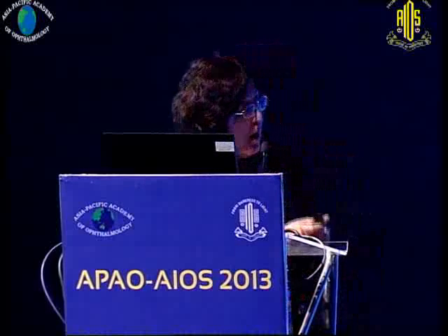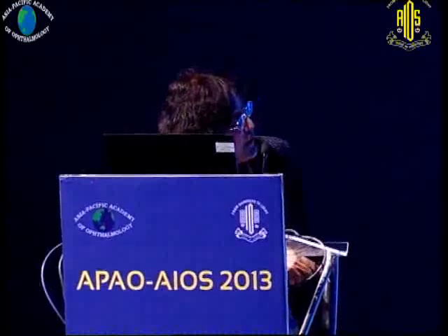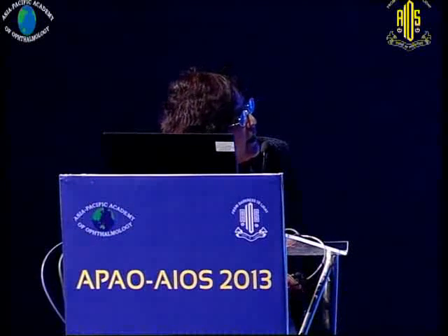This is the outcome of the visual improvement. We see here that 4 cases improved visual acuity, but just 1 case did not change. In this case, there was a hole. So these 5 cases never used laser, just vitrectomy with ILM peeling and gas. The retina attached after vitrectomy without laser.